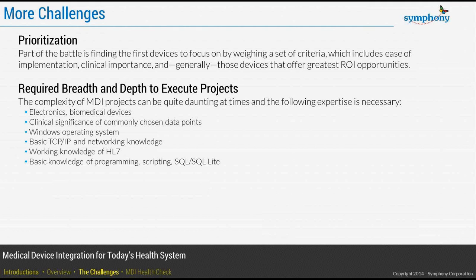If you have someone knowledgeable in electronics, it makes that whole process a lot easier, because you've got devices that contain microcontrollers, and you're programming these in some cases. Someone with that background makes it a lot easier to understand and work with.